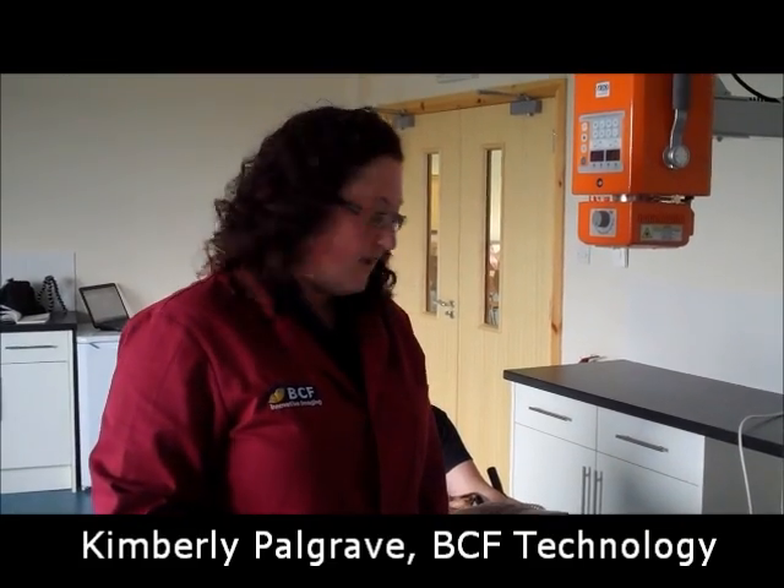Hi, my name is Kimberly Palgrave and I'm the in-house vet for BCF Technology. Today we'll be looking at how to position a dog correctly for performing radiographic exposure of the lateral pelvis.